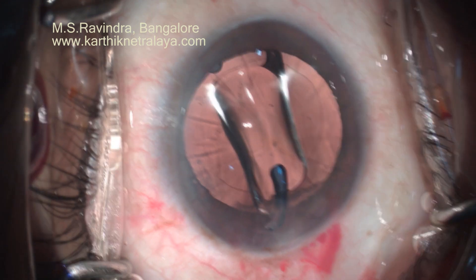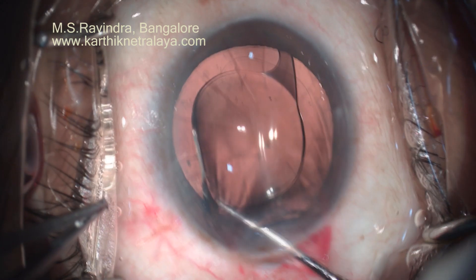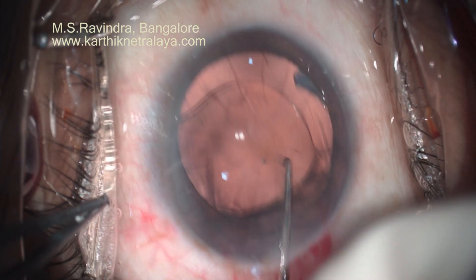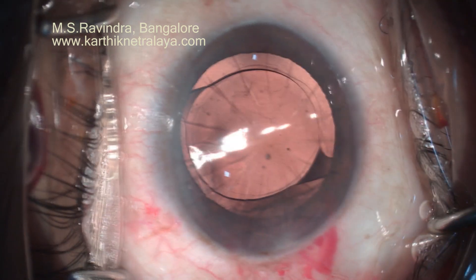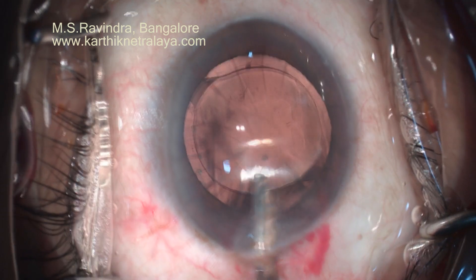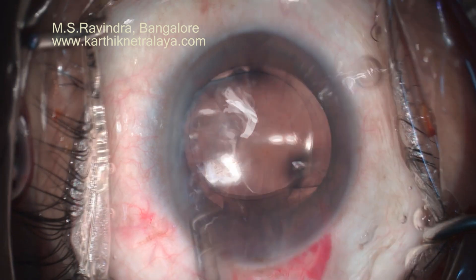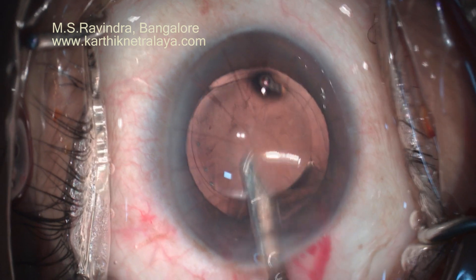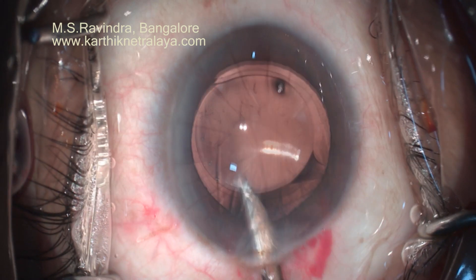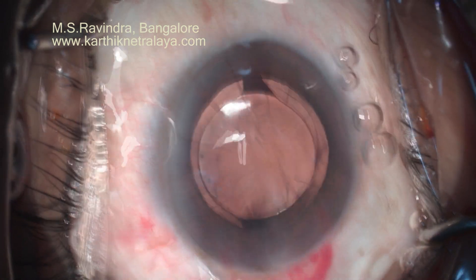The viscoelastic has to be aspirated completely from the anterior chamber, from the angle region, and from behind the endothelium. The Simcoe cannula can be easily taken behind the lens to polish the capsule as well as to remove the leftover visco. The reverse flushing will create a fountain of fluid which can wash the undersurface of the lens so that there is no visco left inside the anterior chamber. The angle has to be specifically washed to get rid of the visco that has gone there.